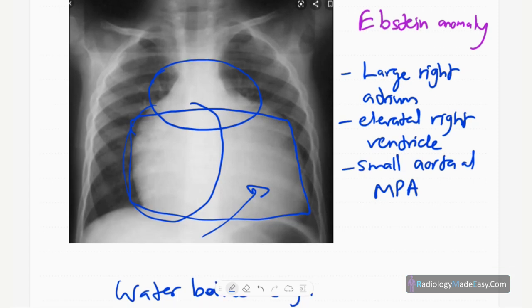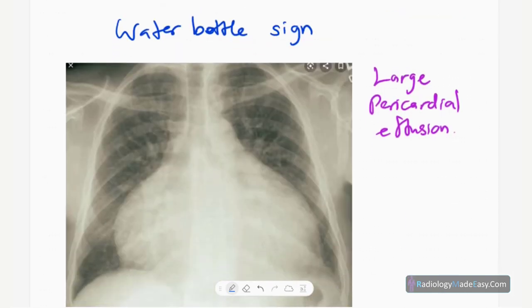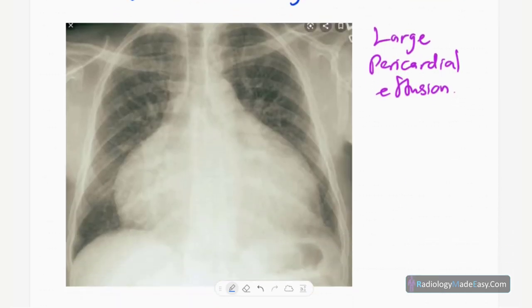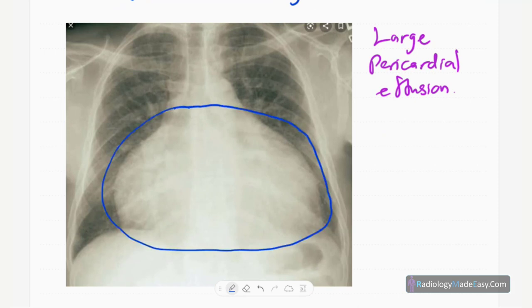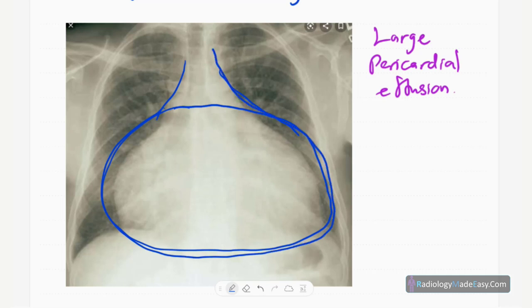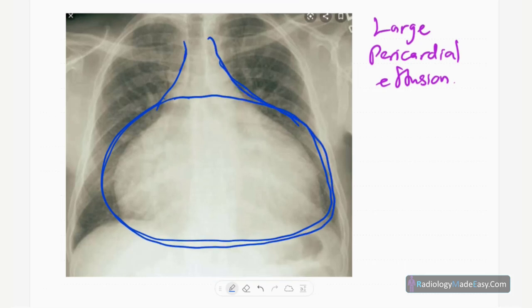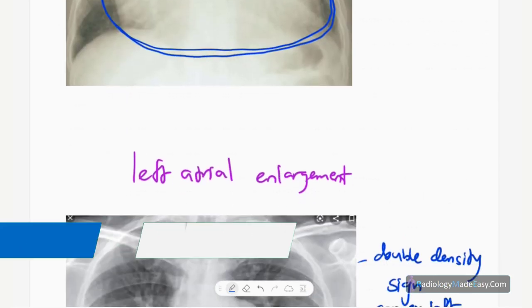Next is the water bottle sign, seen in large pericardial effusions. The pericardium is grossly filled with fluid, causing cardiomegaly. The heart takes on a water bottle shape. On ultrasound, you can confirm fluid within the pericardial sac.